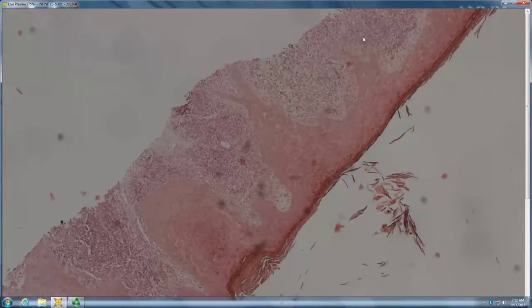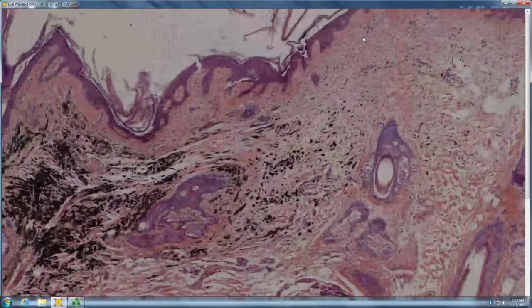So what things give you hypertrophic lichenoid dermatitis? Like hypertrophic lupus. Hypertrophic lupus and you can get LP too. Yeah, hypertrophic LP. And what's going to tell them apart most reliably? Well, you can get more follicular plugging and DIF. Any study you can get? DIF. Yeah, exactly. That's one where DIF is just golden. So not all lupus is positive on DIF, but all hypertrophic lichenoid lupus is. You know, it's a strong granular band, lots of IgM around the follicles.